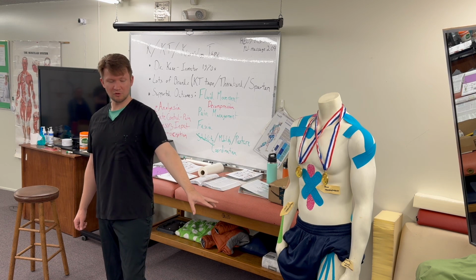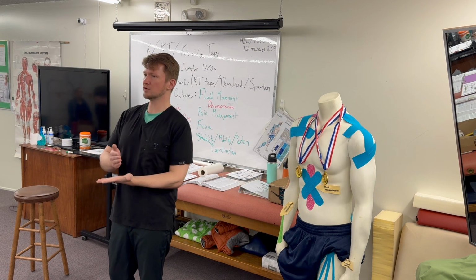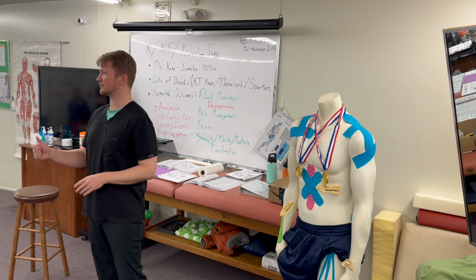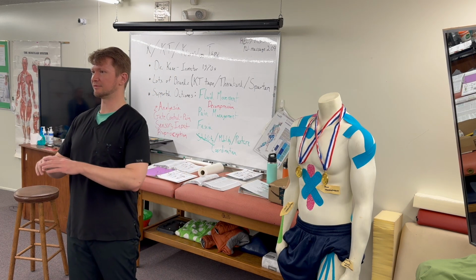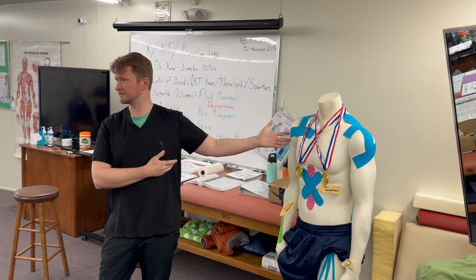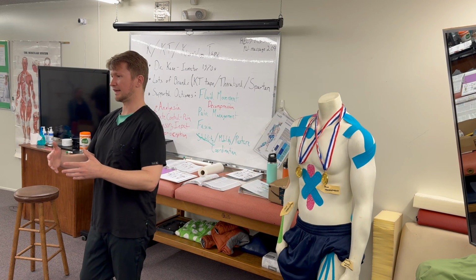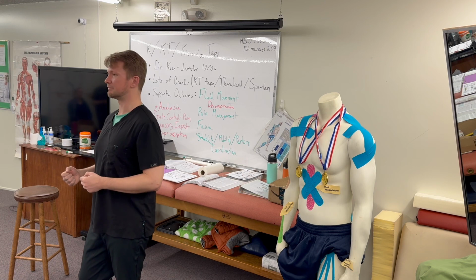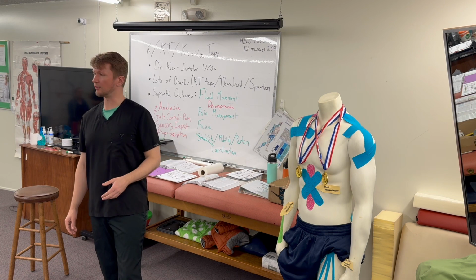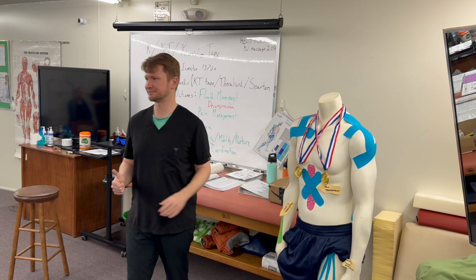whatever it may be, movements at a particular joint or postural related things, if we can help cue a person to start holding their body by itself in a better orientation, we're getting them to strengthen those muscles, and ideally eventually they can just hold themselves there without the extra feedback, or through using massage or other things. That can be a way to help a person teach their own body to hold a better posture and orientation. So I like the idea of saying this is the goal, even if you just feel this and it reminds you, hey, that's great.